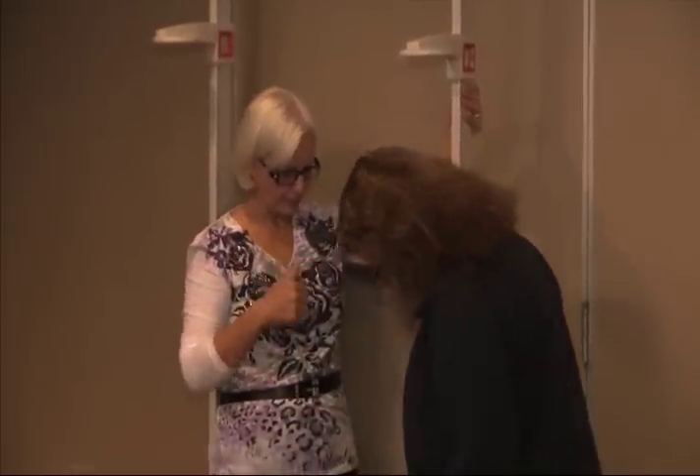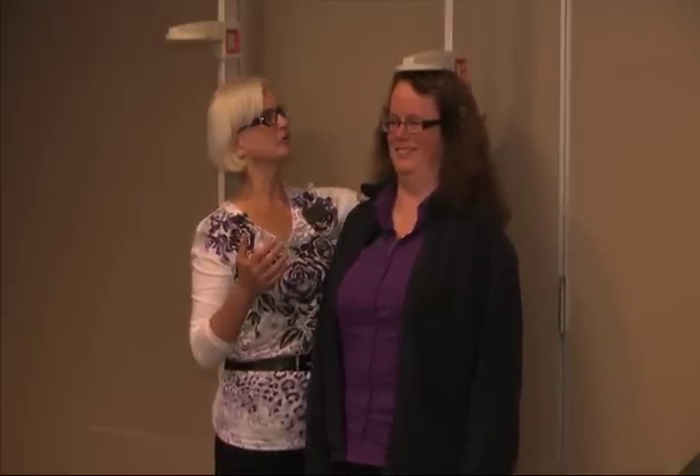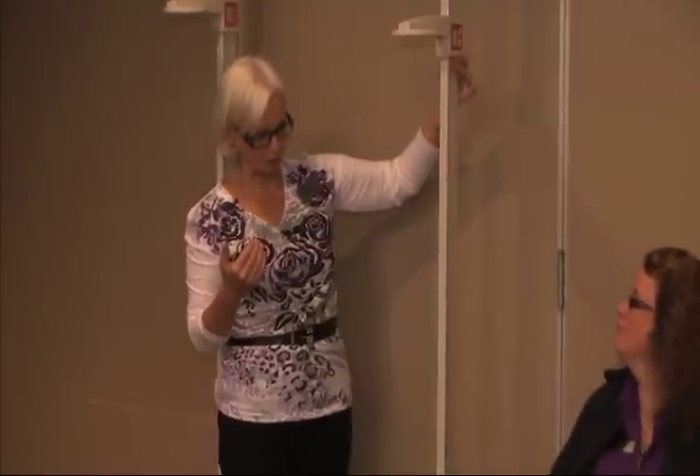Just relax, step forward, and back again. As they do a second measurement, their posture muscles will adjust slightly and they may decide they can be a little bit taller. This time I got five foot four inches. Now think tall — show me how tall you really can be. Let's kick in a few posture muscles and see what can happen. And I've got five foot four and a quarter inches again. Five foot four and a quarter inches for recording on your chart.